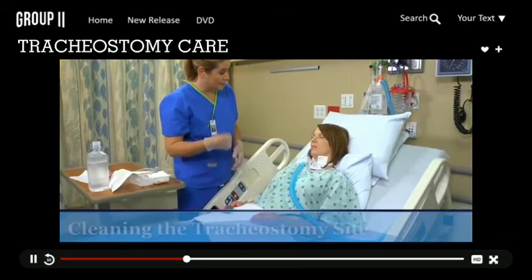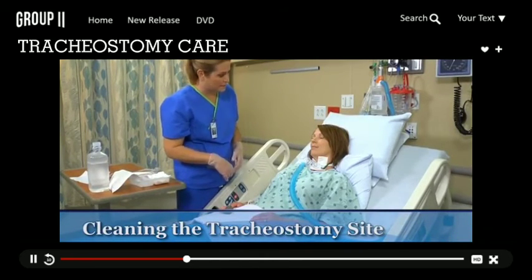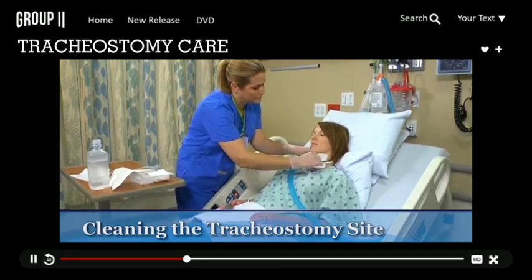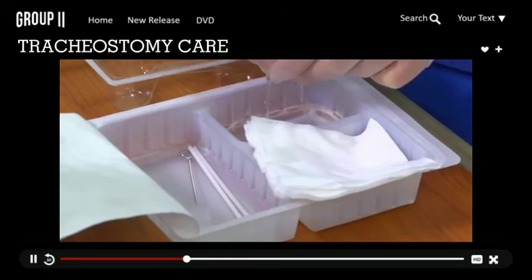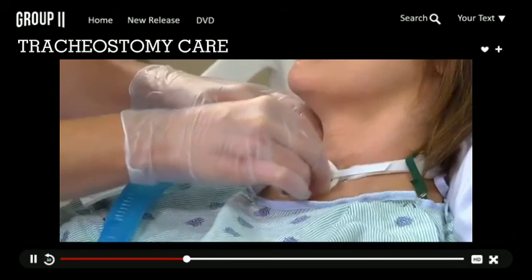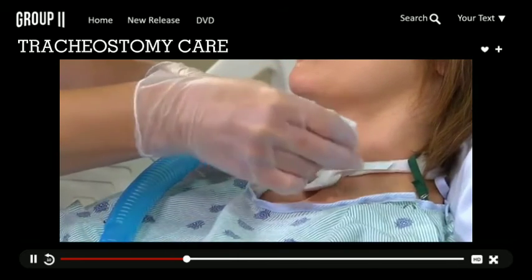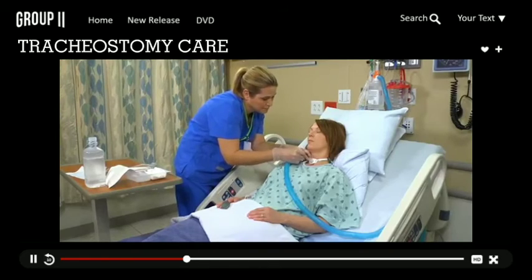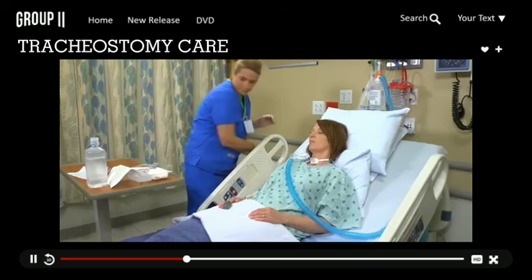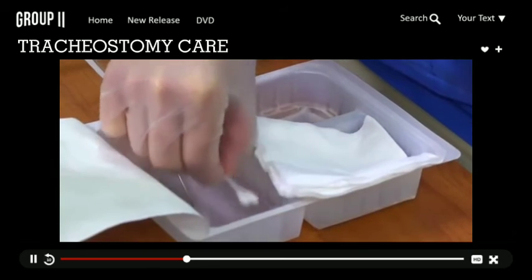I'm going to clean around the tracheostomy site and change the dressing. With either type of cannula, remove the drainage sponge and use normal saline to clean the exposed surface of the outer cannula. Then clean the stoma.